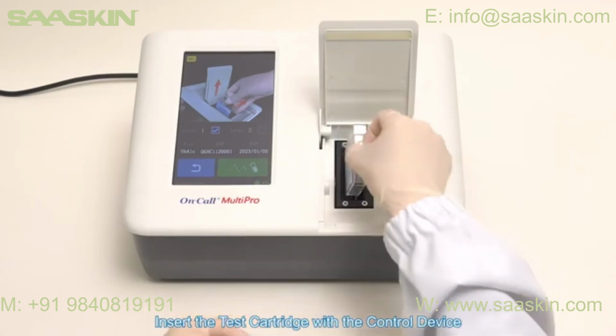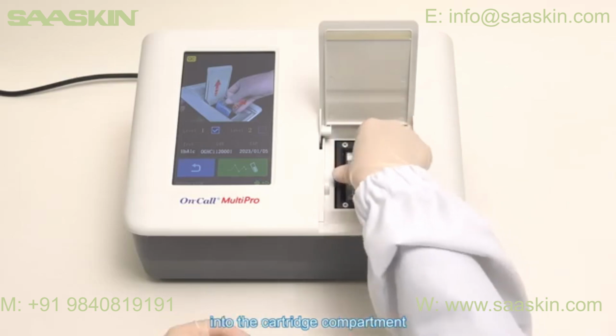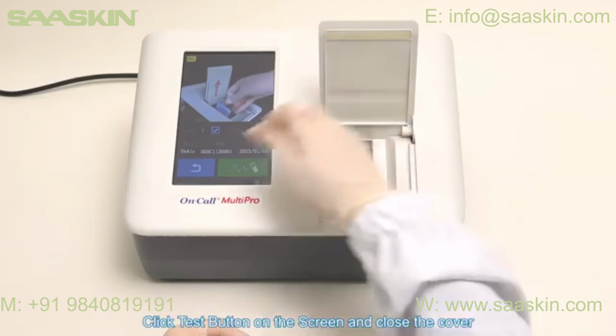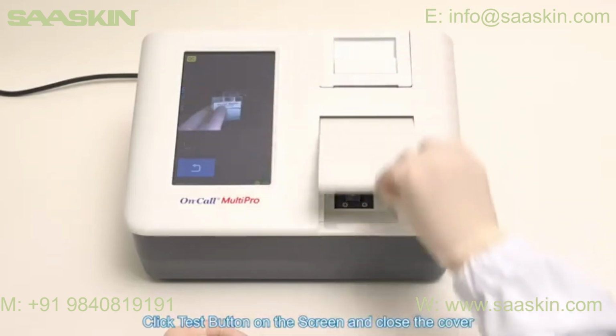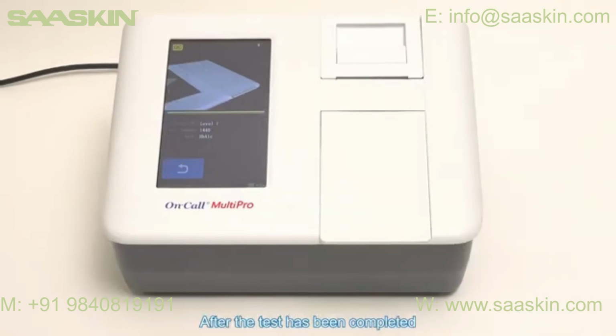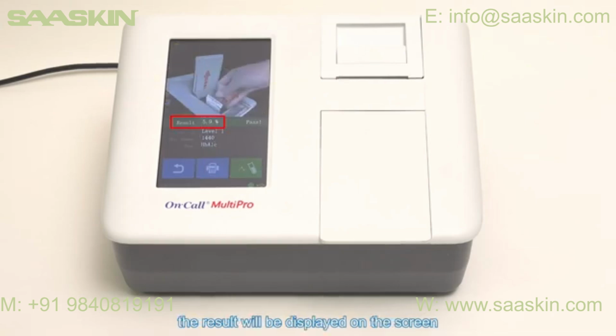Insert the test cartridge with the control device into the cartridge compartment. Keep the label of the cartridge facing left. Click Test button on the screen and close the cover. The QC test will start automatically. After the test has been completed, the result will be displayed on the screen.